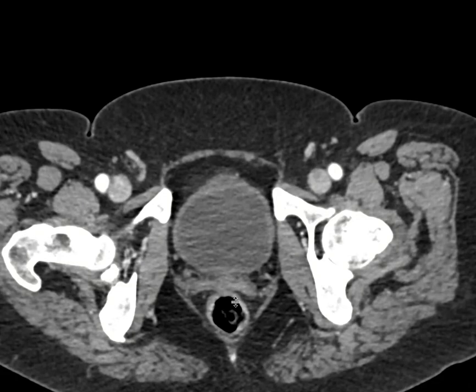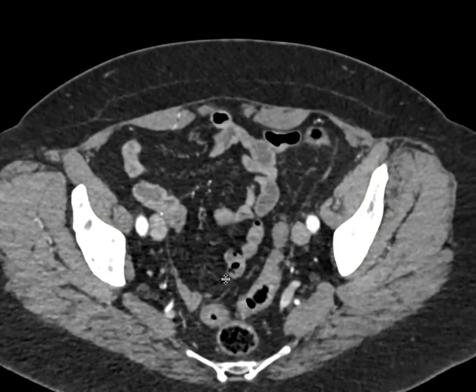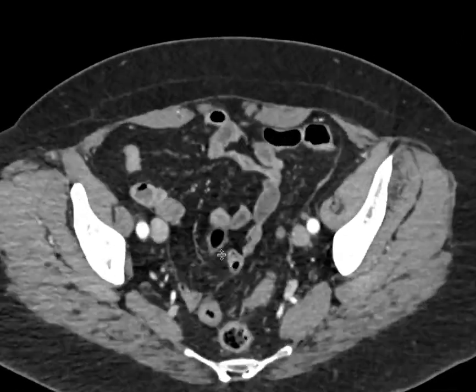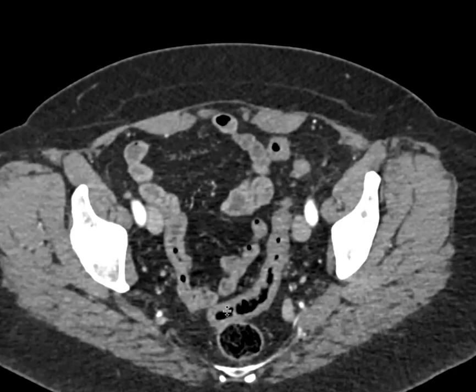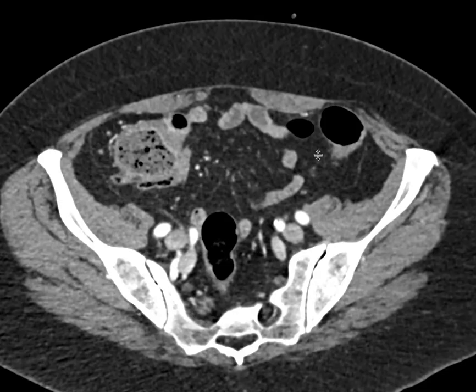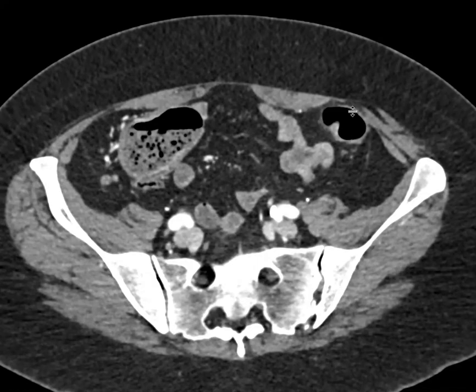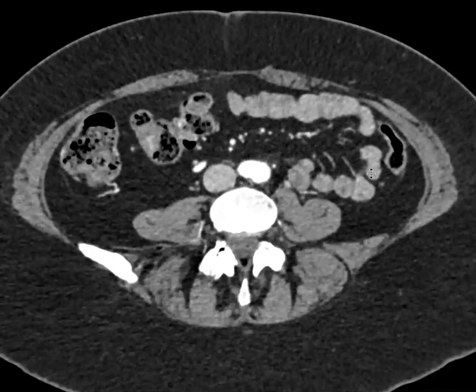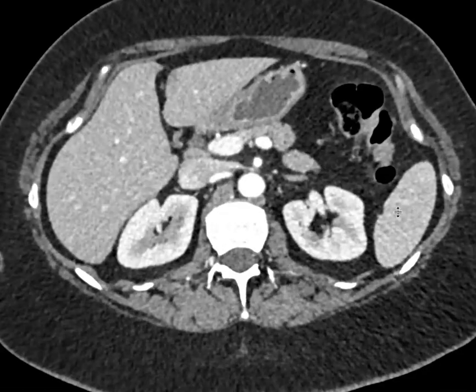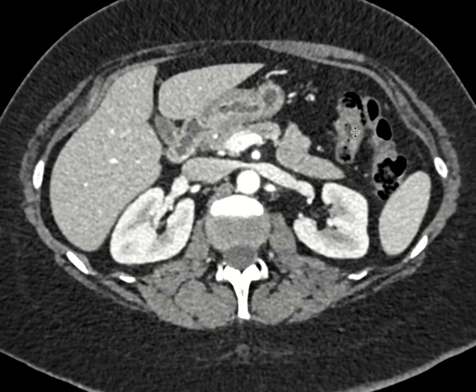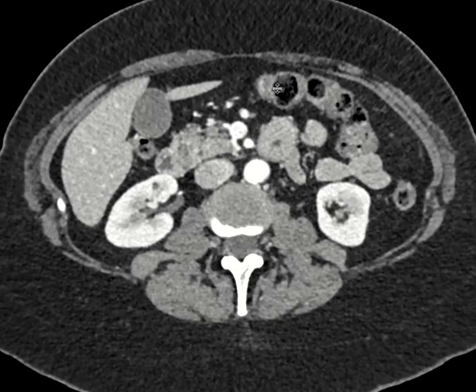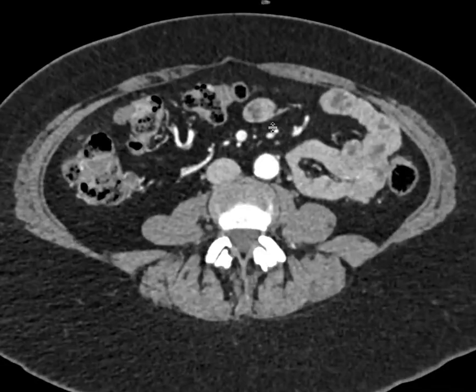So I start off with the rectum. You follow the rectum back — here we have the sigmoid colon. We follow the sigmoid colon up and then around, and then we have the left colon. We follow that up to the spleen here. Here we have the splenic flexure, and then this is going to be our transverse colon.